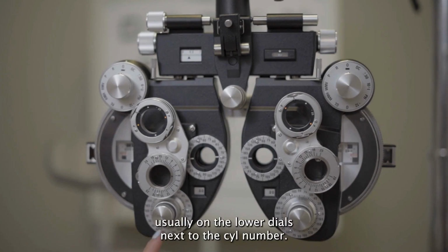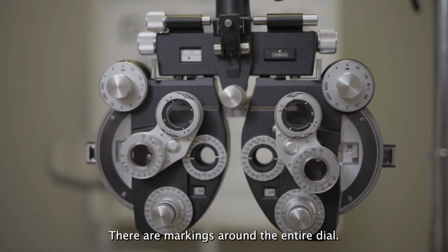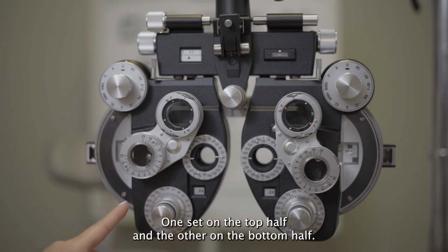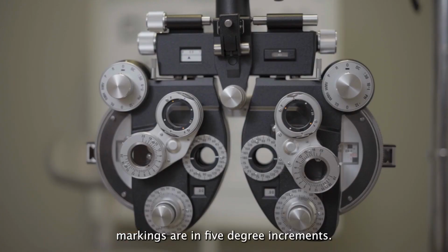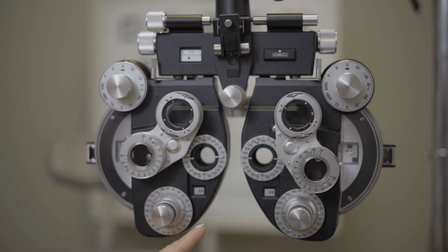The axis is usually on the lower dials next to the cyl number. There are markings around the entire dial. However, the dial is split into two sets of 180 degrees, one set on the top half and the other on the bottom half. The axis markings are in 5-degree increments. The axes markings are the same 180 degrees away from each other.